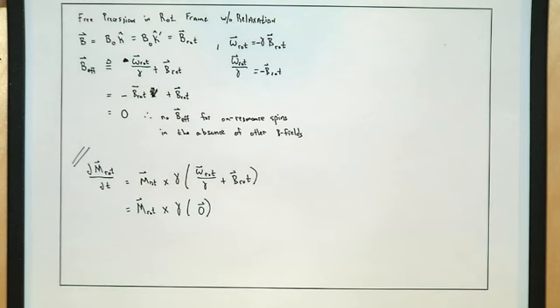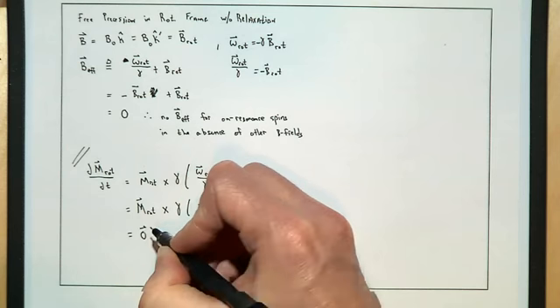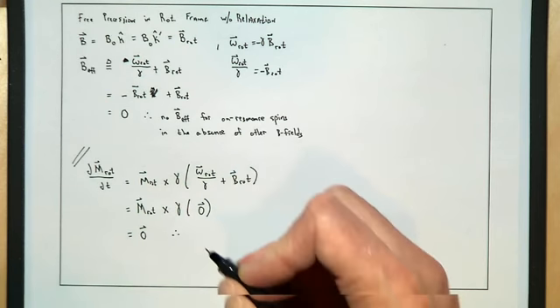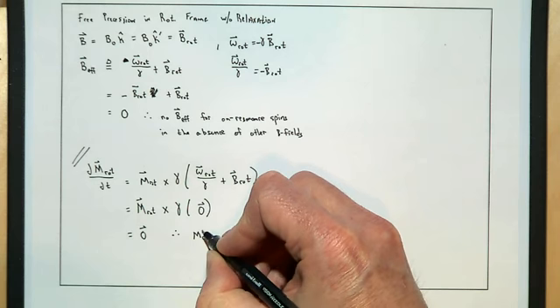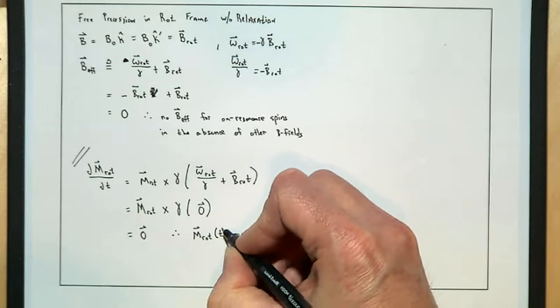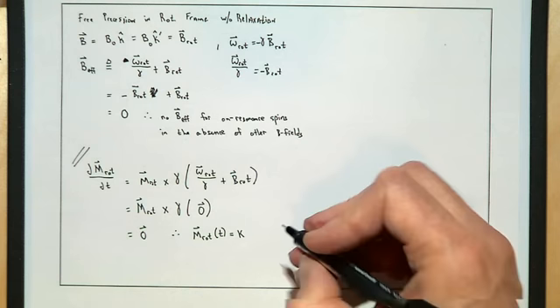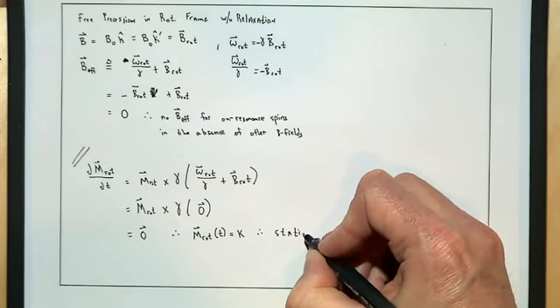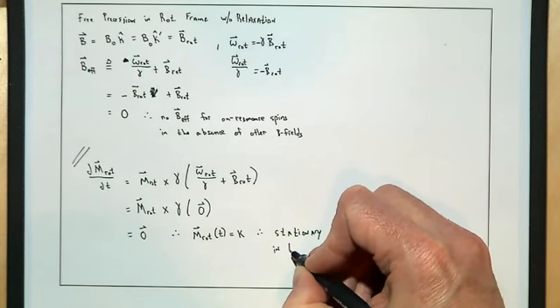And so that means that the time rate of change of all components in the rotating frame is just 0. It's just the 0 vector. So by inference, if the time rate of change is 0, then the components of the bulk magnetization as a function of time are just equal to some constant. And so that means they're effectively stationary in the rotating frame.